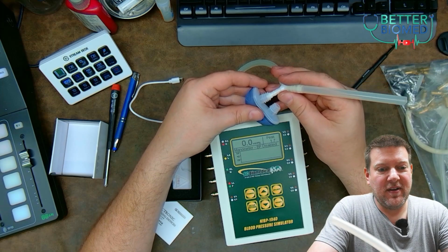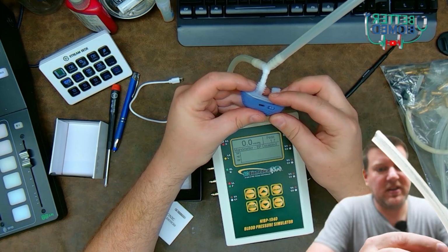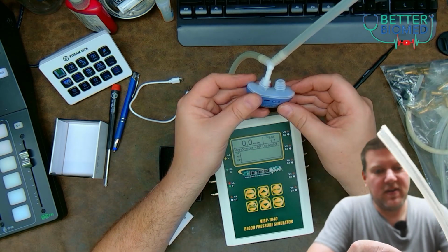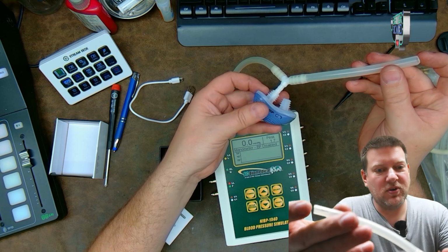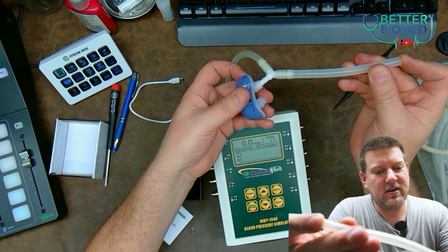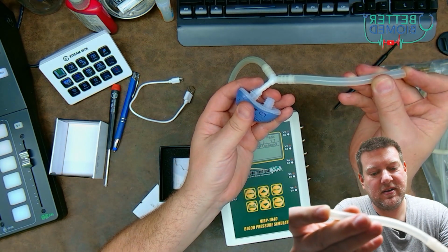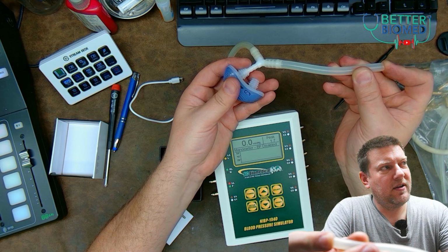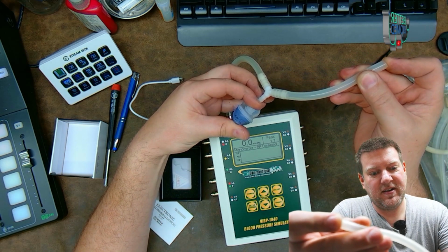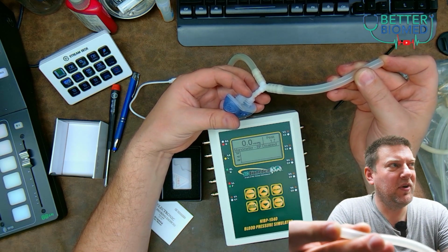Okay, folks, if this thing works, which right there, that's a tight seal. Oh, let's put that jacket all the way around. Okay, the jacket's on. I'm going to occlude it, from here and here. Come on, give me something. Okay, let's try this other one. I don't even have 0.1 of a millimeter of mercury.